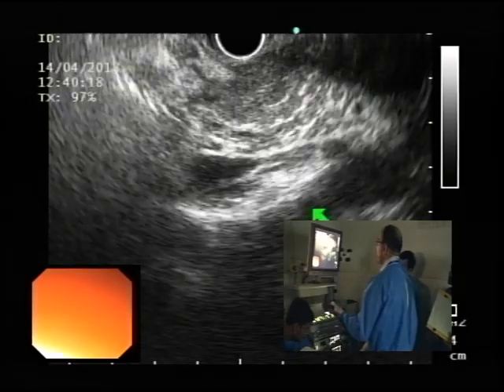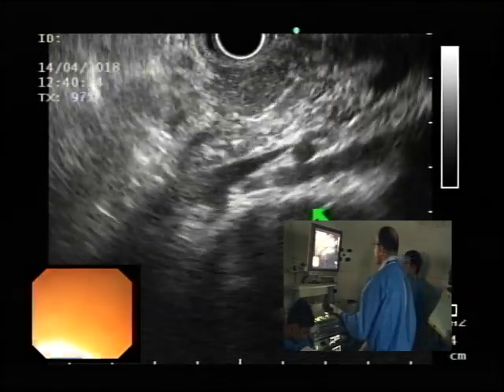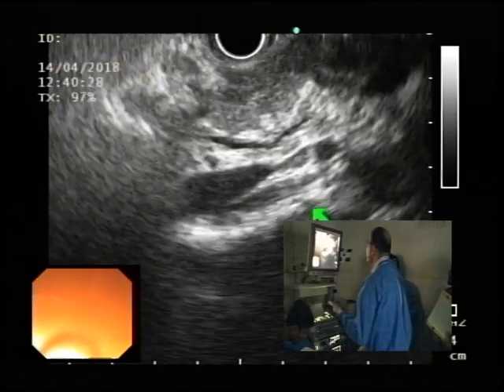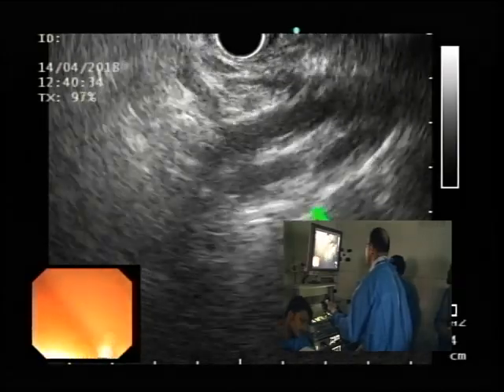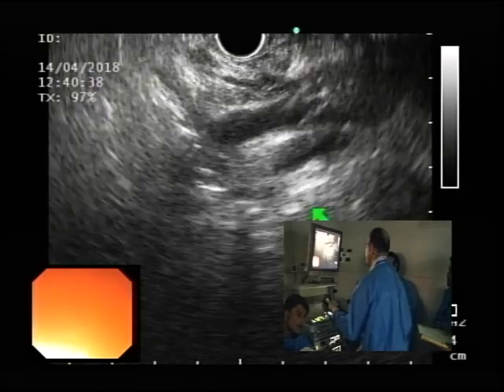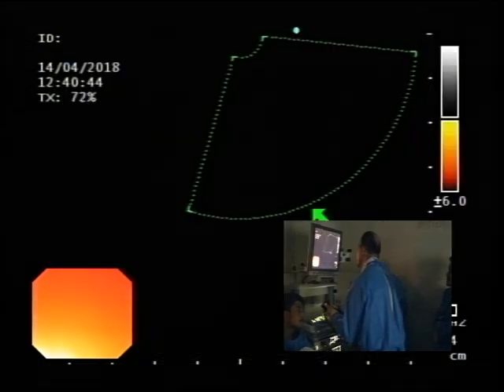No problem. Anyhow, this is a pancreatic duct, which, as we pull back, we can see will cross over the portal vein. What I haven't confidently seen here is the bile duct, though on some views I thought I had it with air in it. Because this I feel is SMA and SMV. This is a branching of the same vessel, but this is where maybe power Doppler will help us.